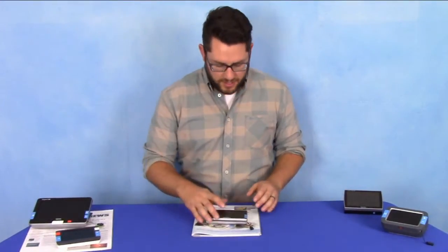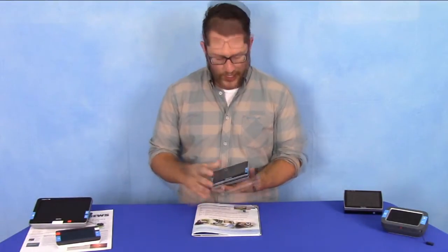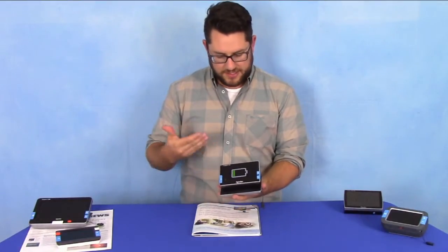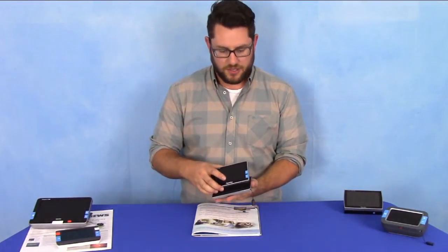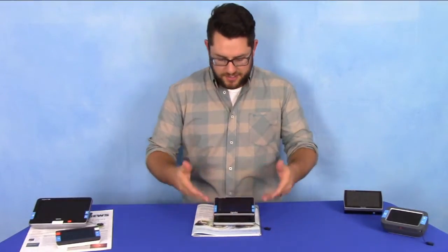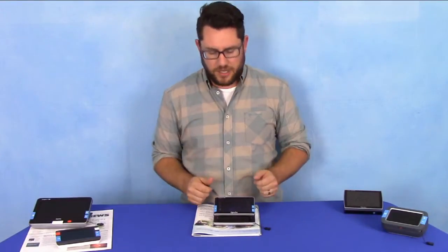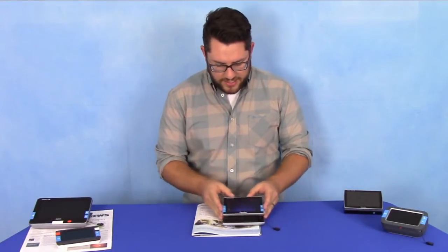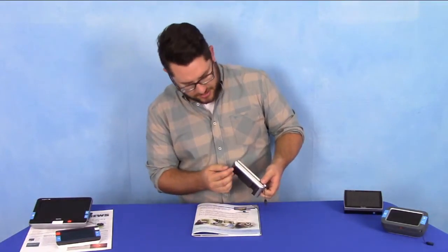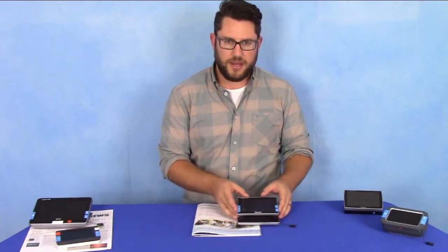As with all Optelec products, it's very simple, very elegant, and very easy to use. I'm simply going to pop this open — the screen actually comes up, and as it does that it will automatically turn on. This presents a very ergonomic, comfortable reading position. The screen is tilted towards the eyes, so I'm not bending my neck or hunched over. It glides easily across the page — on the bottom it's got a rounded edge with special gliders and plastic coating to slide easily along the pages.